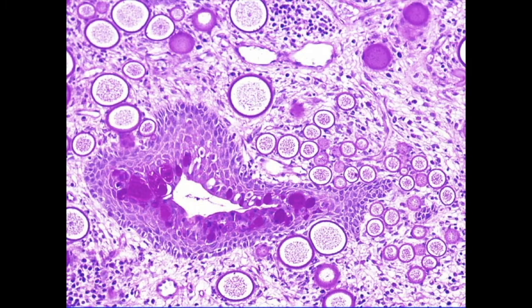This is a rare infectious disease, actually caused by an organism that's probably a fungus, called rhinosporidiosis. The lesions are said to look like strawberries with white seeds. The white seeds are actually sporangia. Here's the classic histopathology of rhinosporidiosis, the round trophozoites. This is most common in India. It was said to be seen in so-called Indian sand divers.